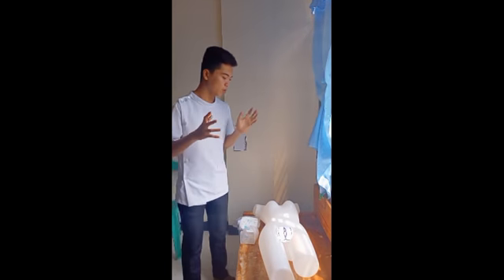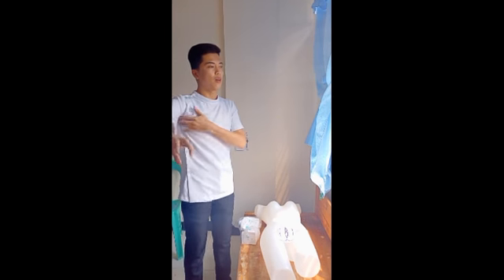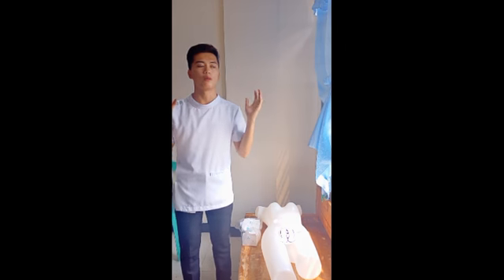I'm going to perform female catheterization. I'm going to assist the client's needs for catheterization, and I'm going to review the client's medical records or any pathological condition. I'm going to ask the patient or check if the patient has any allergies, symptoms of a health condition, or something wrong in the health of my patient.